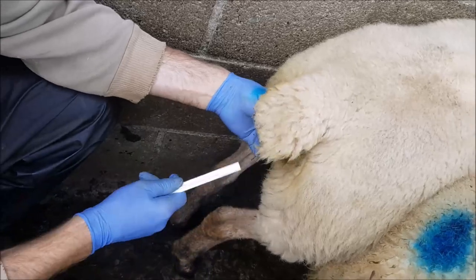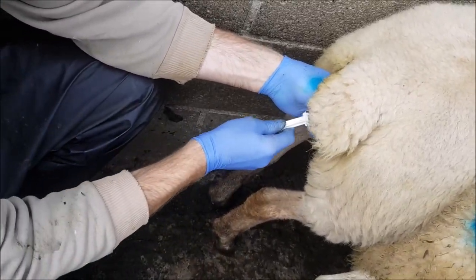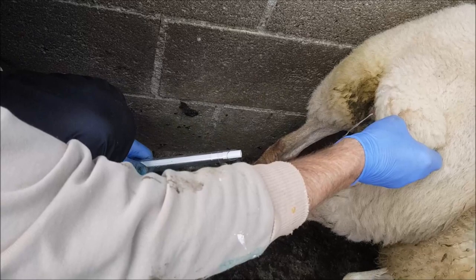If they are hoggets, you probably have to break the hymen, and that is not a nice job. Then slip it out — you should be left with a string.